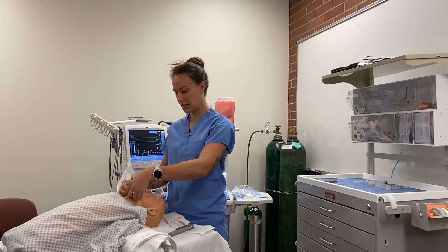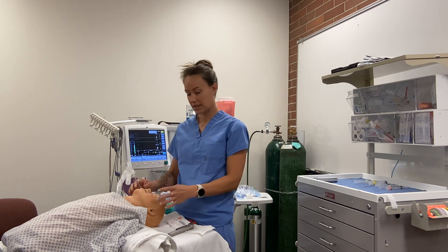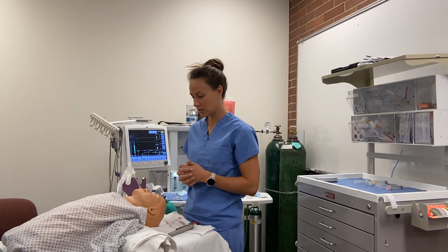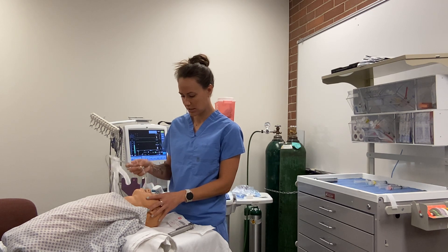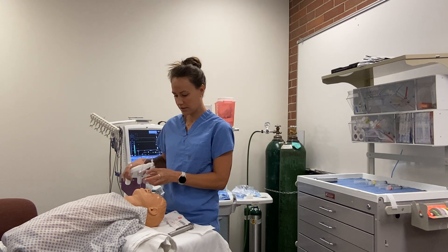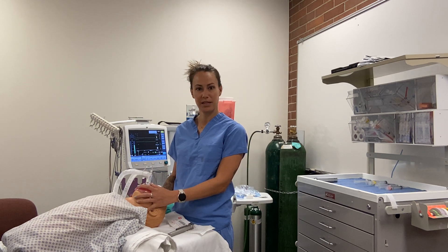First, we suction out the patient and make sure there's no cough or gag response, confirming airway reflexes are still diminished. We check that tidal volumes are adequate — 6 to 8 mL/kg — and the patient is breathing spontaneously. Once confirmed, we pull the tube and move to mask ventilation. As the patient goes through Stage 2 again on wake-up, they are once again at risk for laryngospasm and bronchospasm, so always keep that in mind.